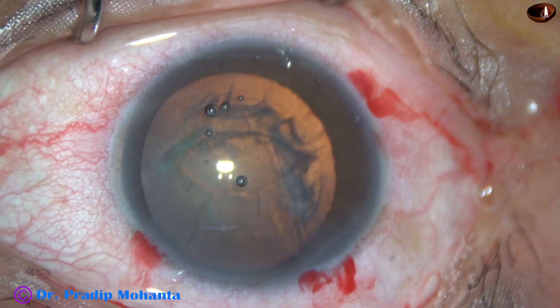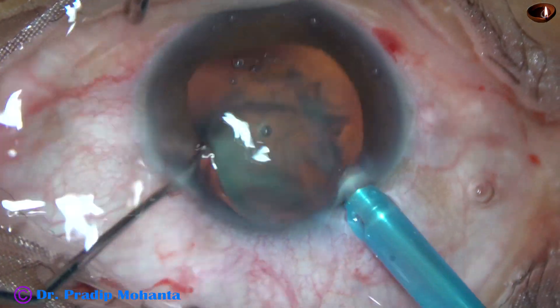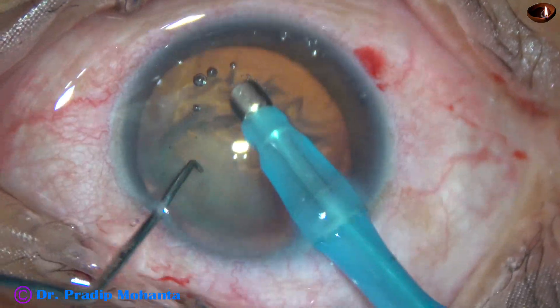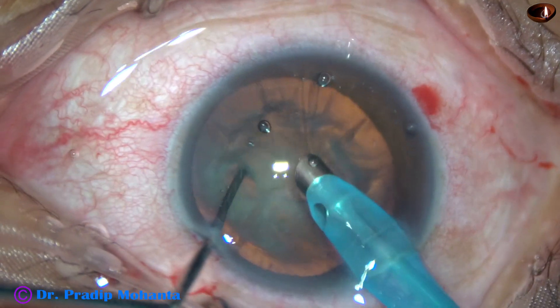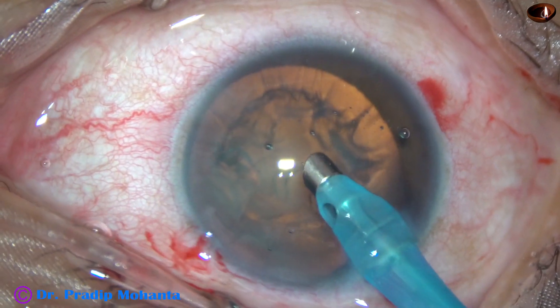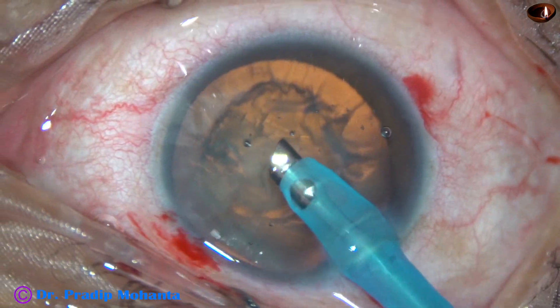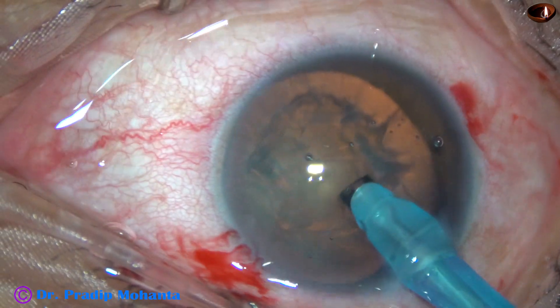Now the tricky part in this case is the nucleus management. And see, as soon as the faco tip goes in with irrigation, the pupil dilates. Once the lens-iris diaphragm goes backward, we get a very deep anterior chamber.